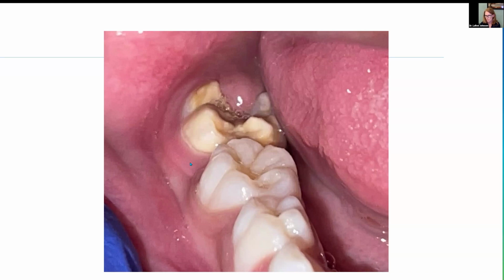So I would do an intraosseous injection, the mesial of the 6. I would make sure I had contralateral blanching to ensure I had appropriate diffusion. And then I would go back and I would do just a couple drops, probably with the interpapillary, just so it's real compassionate, right into that big hunk of operculum, just to make sure I can push it out of the way. And it'll push out of the way, and it'll stay back with the raincoat because it's full of collagen fibers and fibroblasts, and it's very malleable. But if I don't anesthetize it, that hurts. So something to think about.